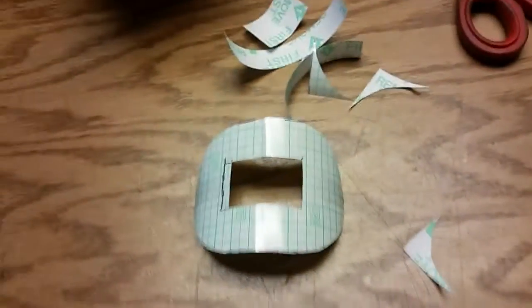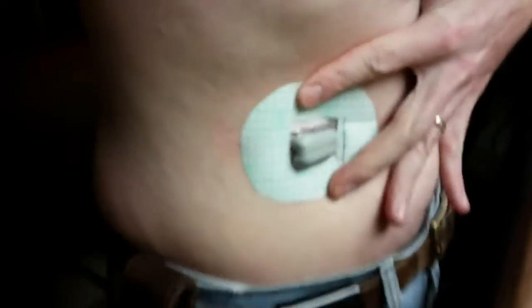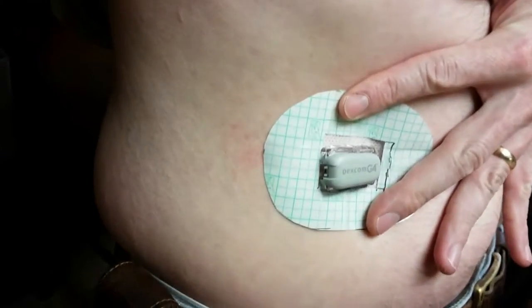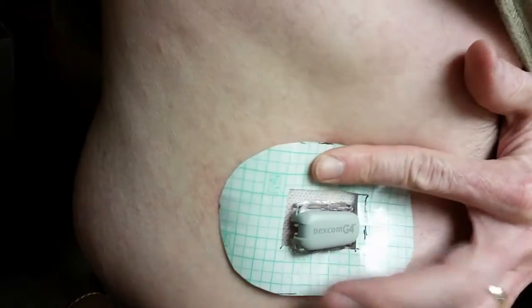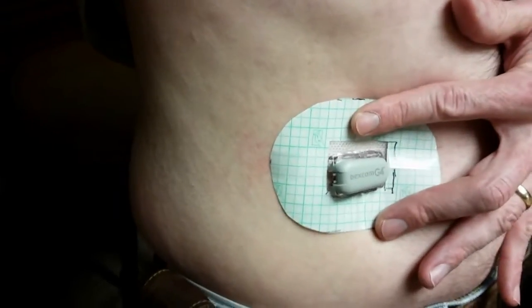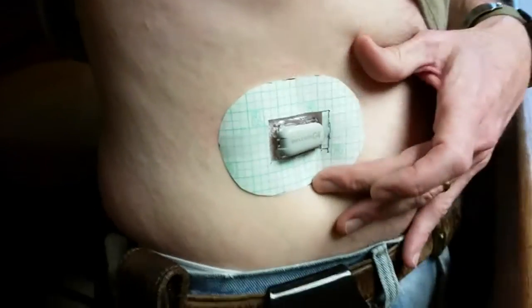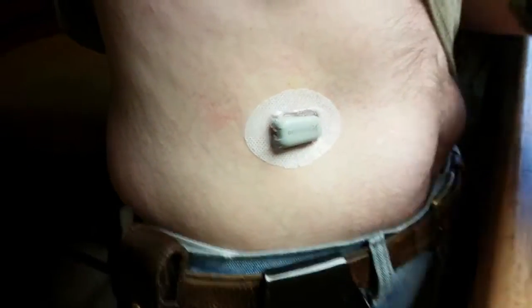Okay, so here's the final product. Just a little mat sheet that goes around a sensor. Let me show you how this looks. It just fits over the sensor and gives you a much wider area of tape than comes with the stock piece. I found that it stays put for generally at least 2 weeks before it starts to get nasty around the edges. So just a second, when I can get a little help to hold the camera, I'll finish this video up by showing you the order of peeling the stuff off and sticking it on.